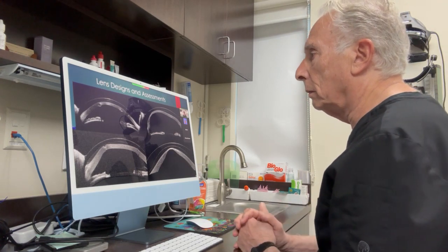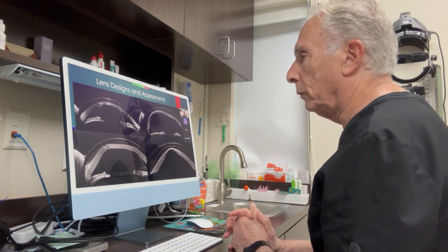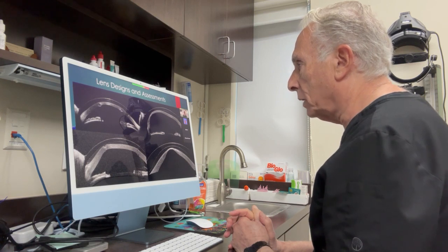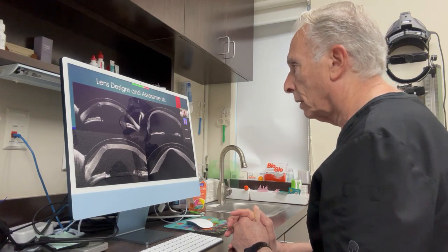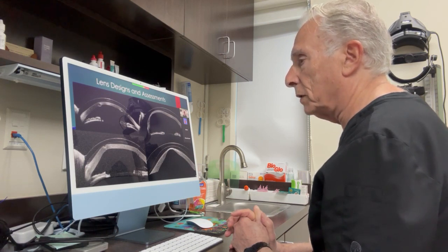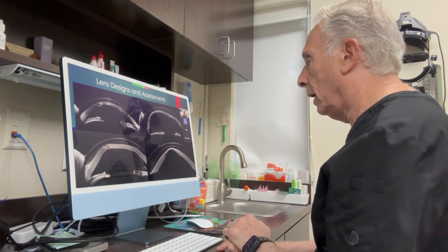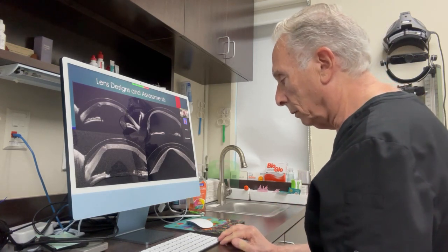These are some of the various corneal shapes that we can work with. The top left is an eye that had Ferrara rings. This is not Intacs, this is done in South America. That's a scleral lens going over that cornea. The next one on the top right looks like a pellucid cornea, but it actually is post-LASIK corneal ectasia, and here we have a scleral lens design that vaults over that. The bottom left is a post-RK cornea. You can see that big cut. And on the bottom right is a nipple cone, a very pronounced, steep cornea. Let's move on.